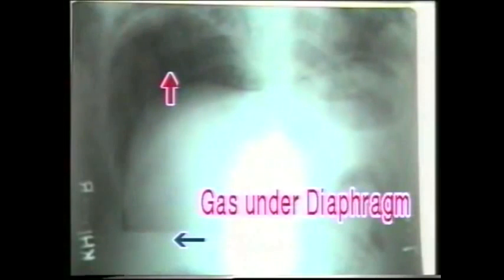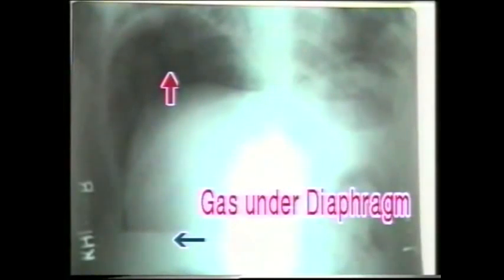This x-ray shows a massive amount of gas under the right diaphragm with a fluid level. When the peritoneum contains a lot of fluid, intestinal fluid or pus, a fluid level is also seen, shown here by a horizontal arrow.